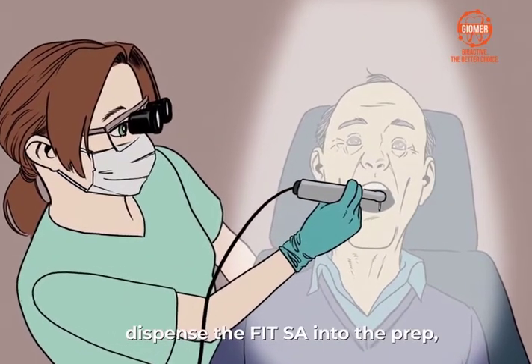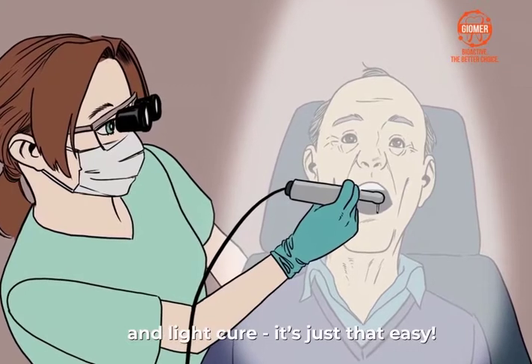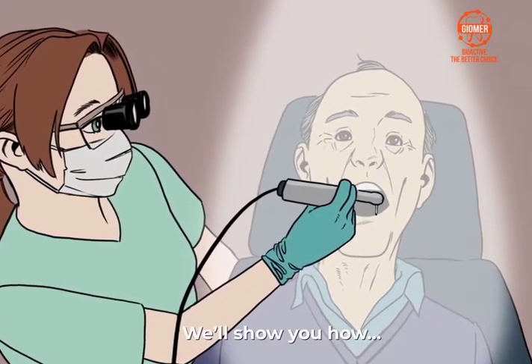Simply prepare the tooth, dispense the FitSA into the prep, and light cure. It's just that easy. We'll show you how.